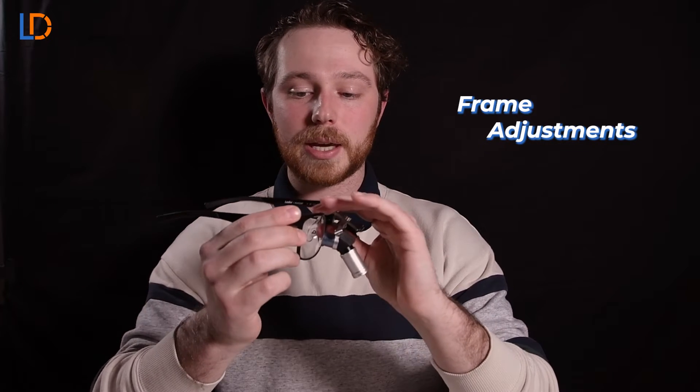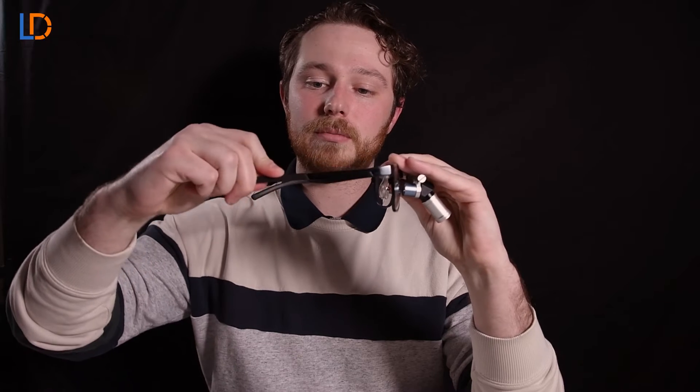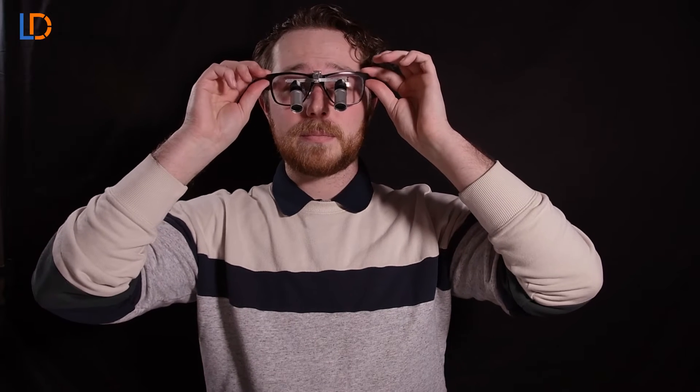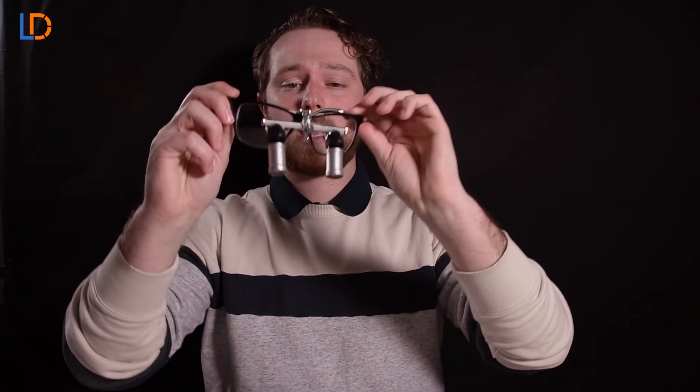Now there are three things that you should notice on the frame first. One is the adjustable temple arms. These are meant to give you a nice snug fit on your ear. So what you're going to want to do is just throw those on and make sure it's a nice snug fit to your liking, and once that's done go ahead and take them off.